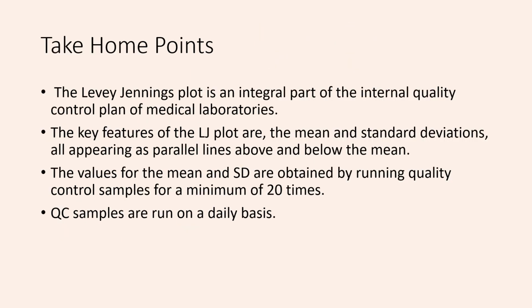So now we come to the take-home points. The Levey Jennings plot is an integral part of the internal quality control plan of medical laboratories. The key features of the LJ plot are the mean and the standard deviations all appearing as parallel lines above and below the mean. The values for the mean and SD are obtained by running quality control samples for a minimum of 20 times. QC samples are run on a daily basis.